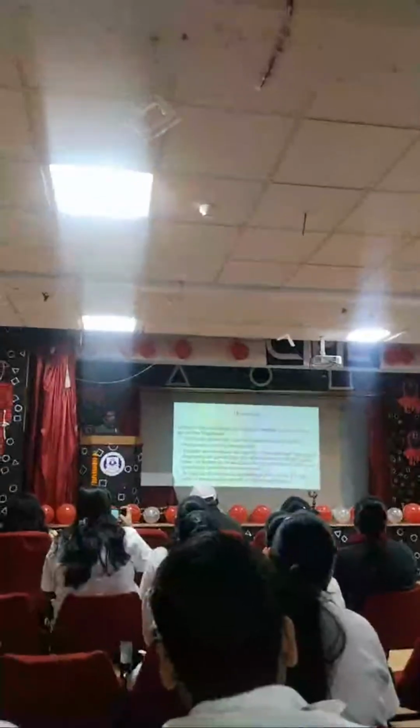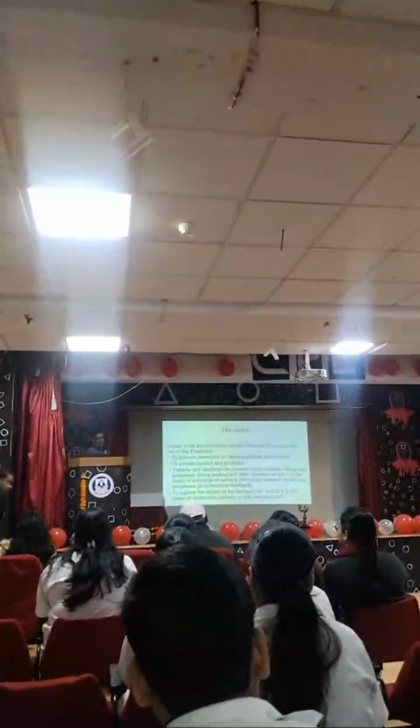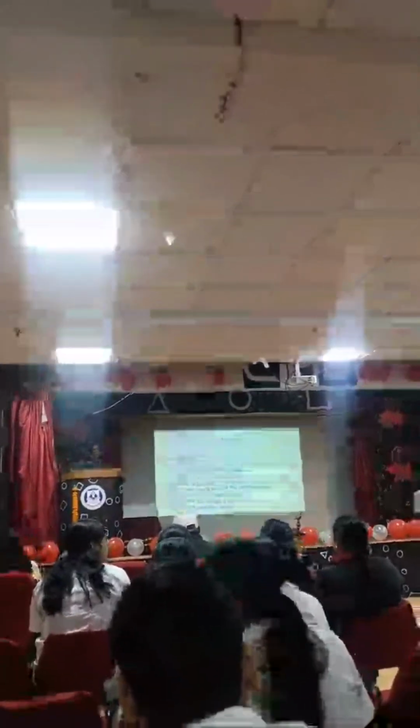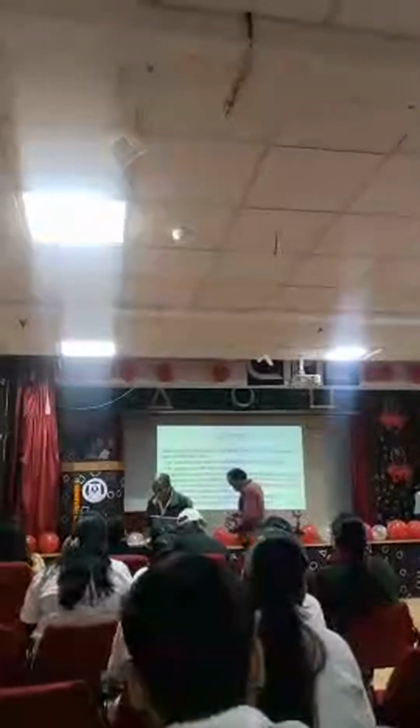Now, going into detail of the socket, because our main topic today is socket design and design variations. So we are going into further detail of what the socket is. What do we understand by socket, first of all? It is a biomechanical interface between the stump and the rest of the prosthesis. Okay, so basically it's a connection. Socket is a connection between the patient and the prosthesis parts.